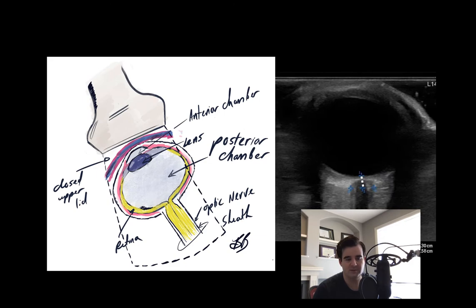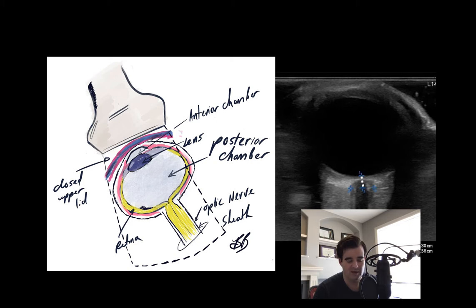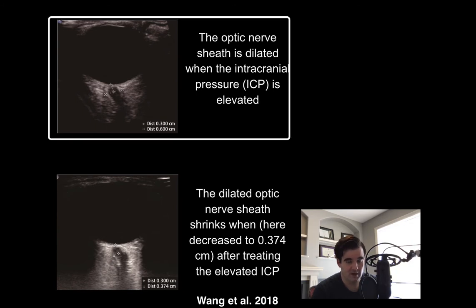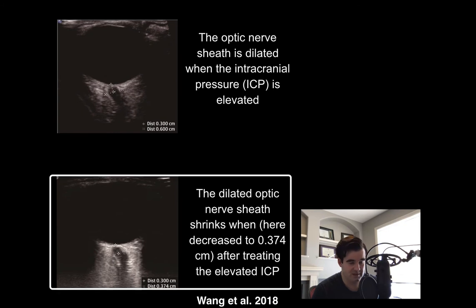The nerve sheath is contiguous with the dura mater, and its contents are contiguous with the subarachnoid space in the brain. Elevation of intracranial pressure can lead to an increase in the diameter of the optic nerve sheath, as you can see on screen left. Notably, a fibrous trabecular network connects the optic nerve to its sheath, and the density of this network can vary between individuals and along the length of the optic nerve. Cerebrospinal fluid flows readily between the intracranial and intraorbital subarachnoid space, so these same areas are subject to the same pressure changes. Multiple studies — including ultrasound, CT, and MRI — demonstrate that the diameter of the sheath does increase in size and is dynamic under changing conditions. These images show elevation of the nerve sheath diameter under increased ICP, and that after you treat the ICP, it does reduce in size.